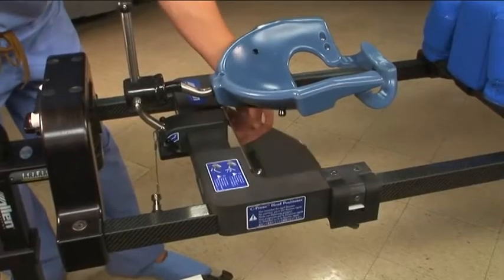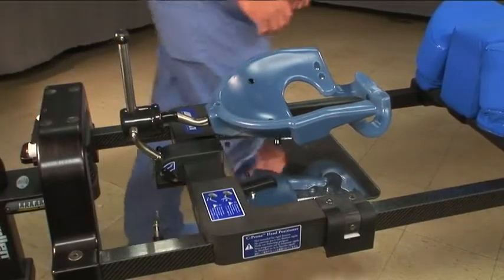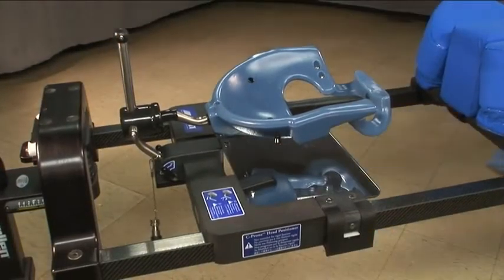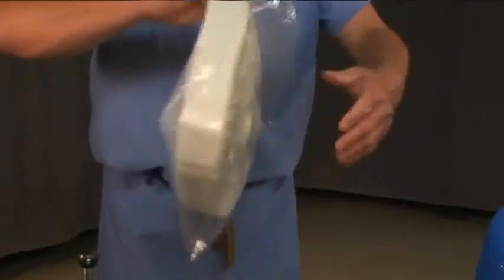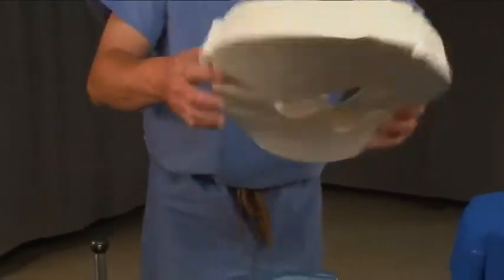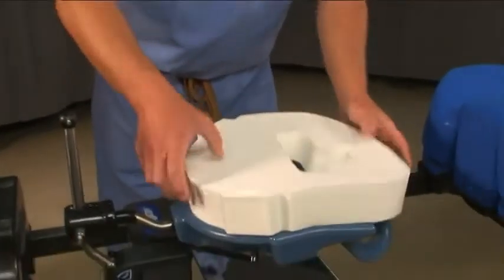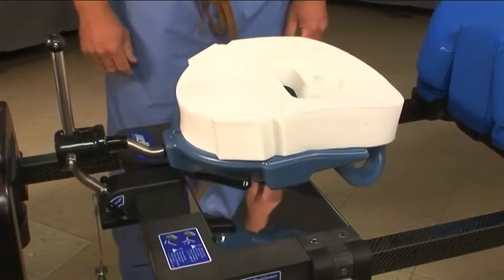There is an adjustable mirror so that the patient's face can be monitored throughout the procedure. The C-prone should always be used with the Allen Comfort Mask — it is a single-use cushion made from latex-free polyurethane foam. Always check to make sure that you have fully locked the C-prone before preparing to transfer a patient.